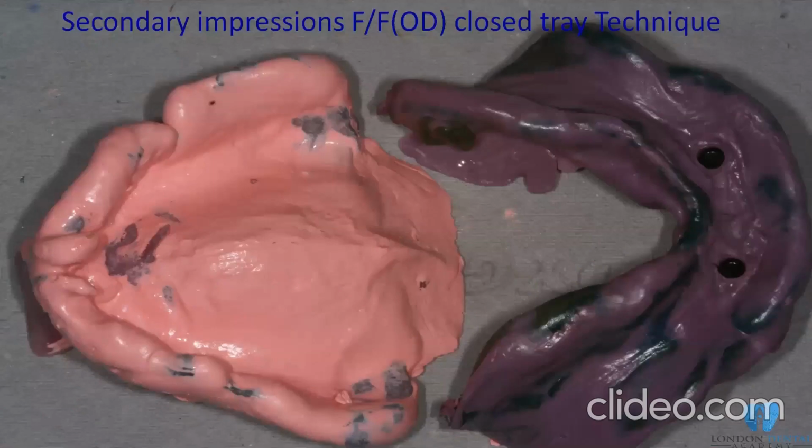So you're picking up, as you can see, with the closed tray technique. This is the upper denture. See how lovely the material flows, the viscosity, the flowability of the material, the border molding. I would know for sure, I would say 90%, this patient will get good retention. I don't think in these cases you would even need implants.